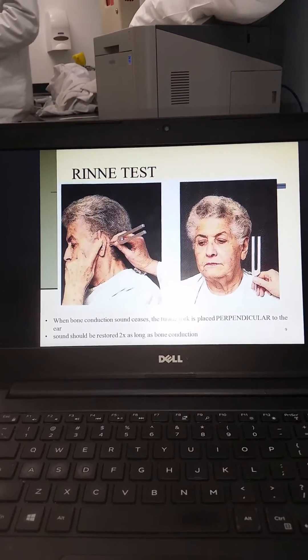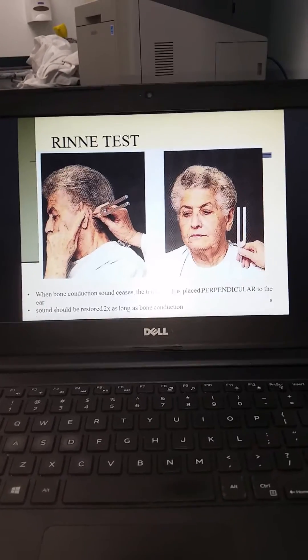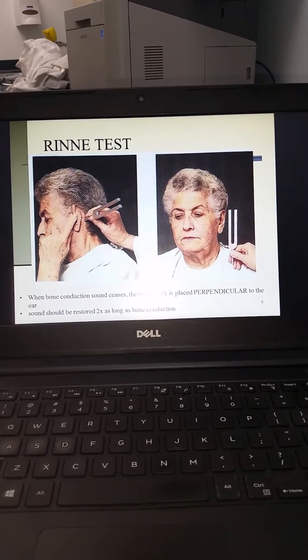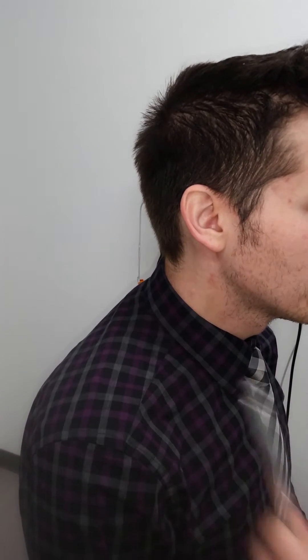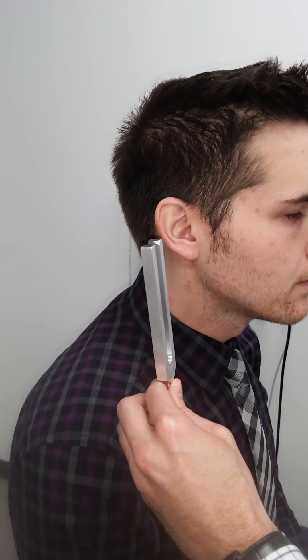For the Rinne test, the tuning fork will be placed posterior to the ear on the mastoid process first, and then held perpendicular to the ear. Sound should be heard two times as long through air conduction as it does through bone conduction. The examination looks something like this: 'I'm going to test your hearing on just this one ear now — let me know when you stop hearing this noise.' After bone conduction is no longer heard, the fork is moved to the air position. You can also test auditory acuity by testing cranial nerve 8 in both ears simultaneously: 'Close your eyes for me and let me know if this sounds the same on both sides.'